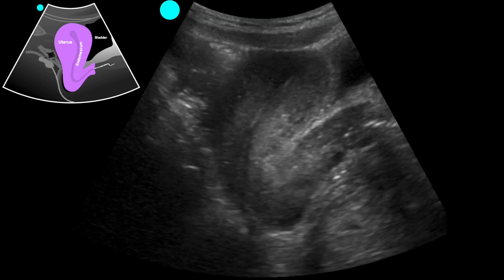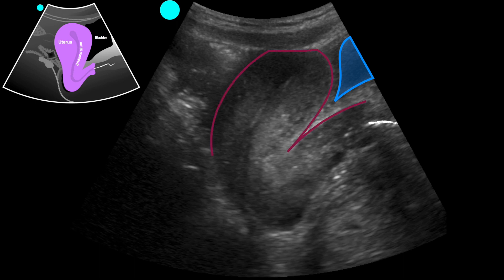The first view is the uterus long axis. You can see the uterus takes up the majority of the screen. Sometimes it's not as obvious, so we recommend using the bladder as a reference tool as well as the vaginal stripe. Outlined here are the contours of the uterus, and our focus should be on the endometrial stripe. As we scan through, we want to look for any intrauterine contents such as a gestational sac.